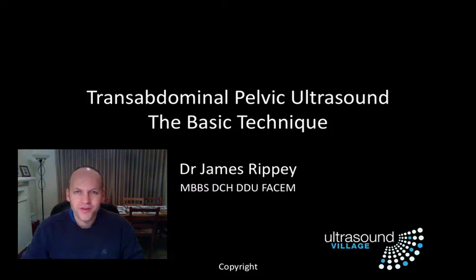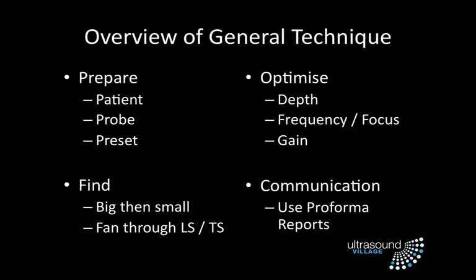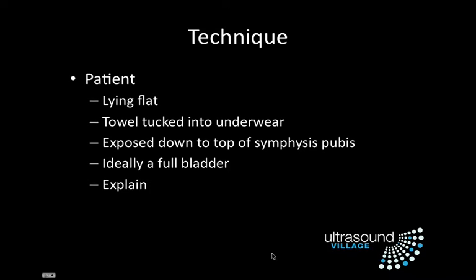Hi, I'm James Rippey and this lecture is on transabdominal pelvic ultrasound, looking for early pregnancy, how to do it and what to look for. The way we do ultrasound generally is we get the patient ready, we find what we're looking for, we optimize our image, and then we let people know what we found. And early pregnancy ultrasound is no different.